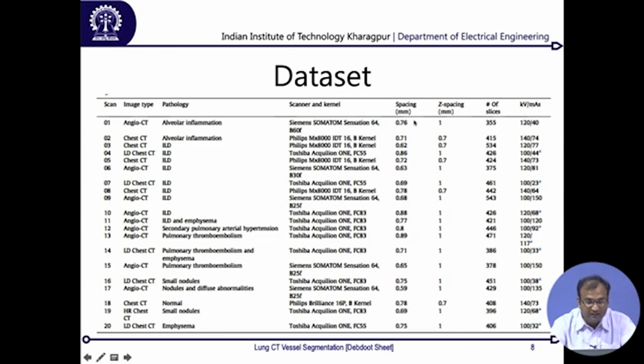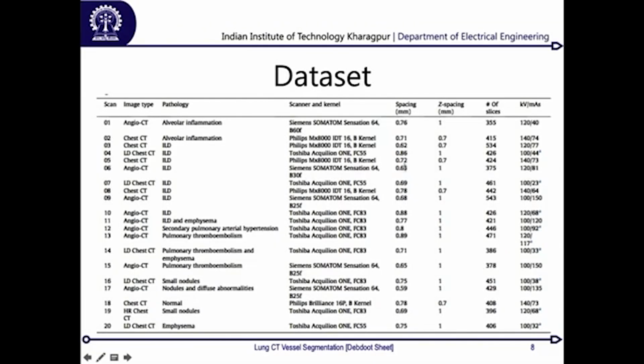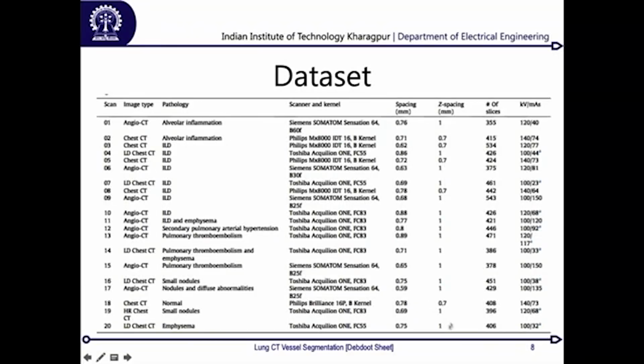On top of that, the spacing in millimeters and the Z sampling. So spacing in millimeters is basically when you have a CT scanner, your detector elements, the X-ray receivers, are spaced at a specific distance. That's the slice spacing between the sensing elements, and then we have the Z spacing. This is the difference between the slices coming down, and this is what the Z spacing is.